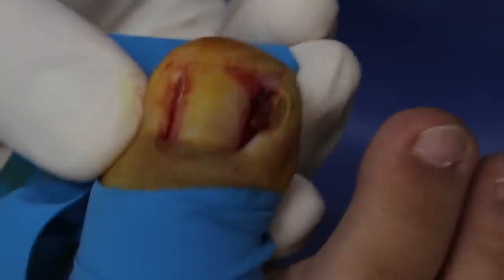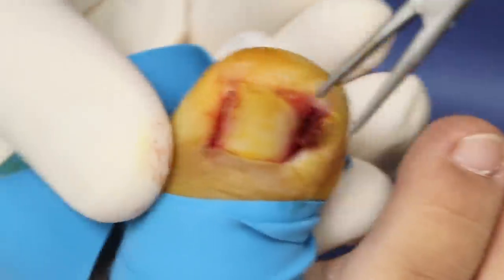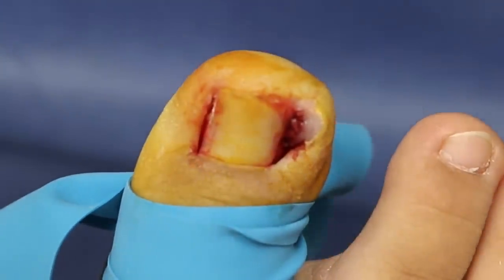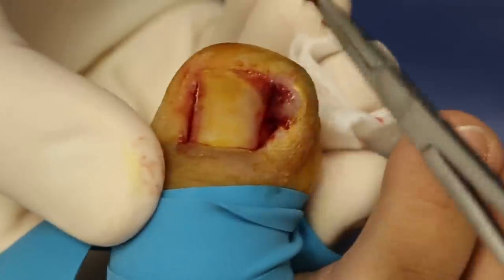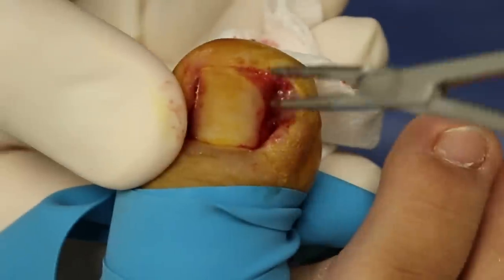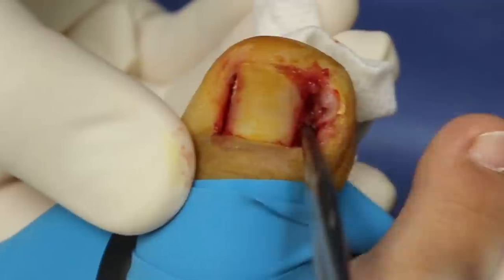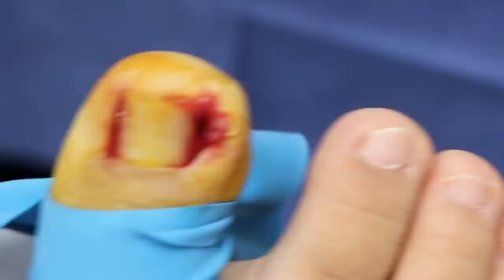So getting all this dead skin out. You're watching! You're not getting freaked out? We can save this and put it in your bubble tea — extra tapioca. So cleaning some of this bad skin out, we're going to get some of this bad flesh. And we're going to see in a second how deep the corners are.